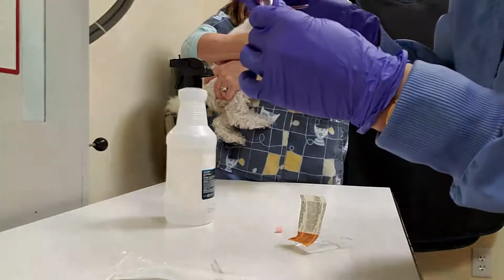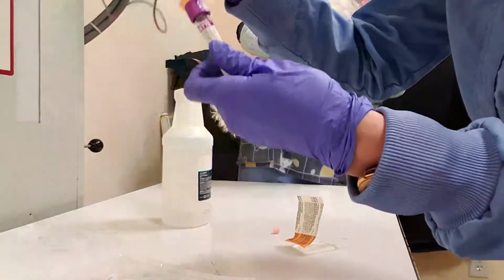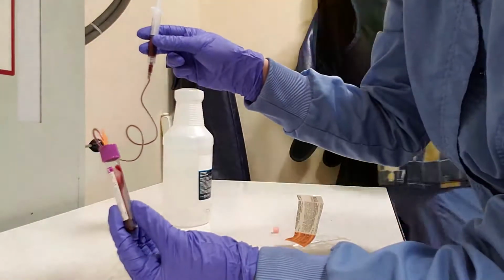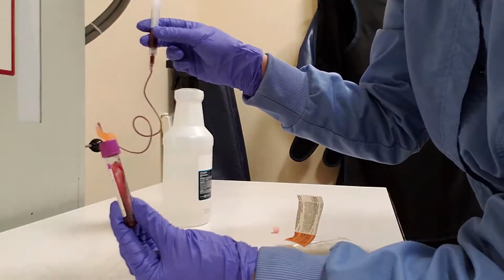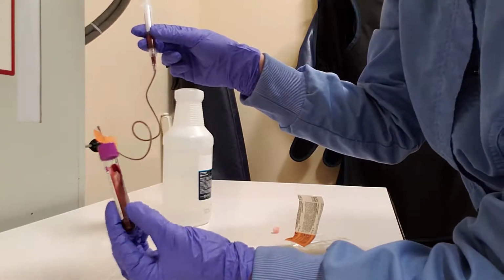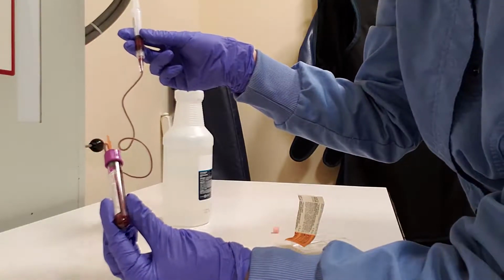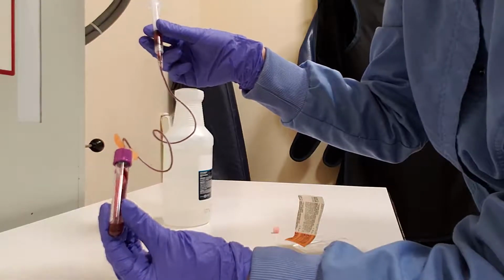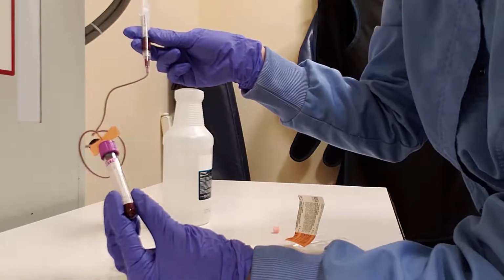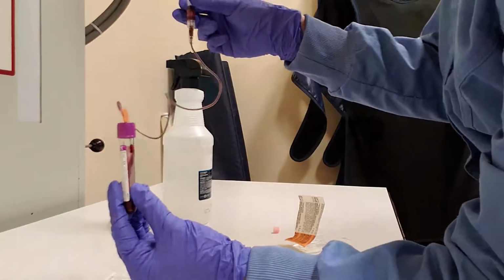All right. Okay. So we will put it into our vacutainer. You're doing just fine. There's alcohol in your arms. She's a very good patient. You did a good job. Okay, slowly but surely getting there. You're okay, Gab. What are you doing, bud?